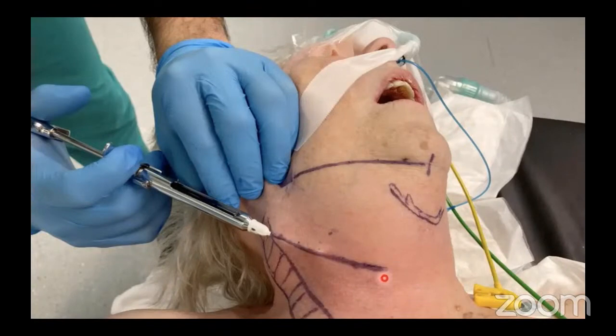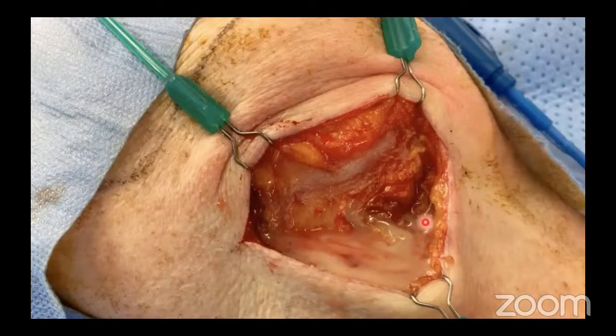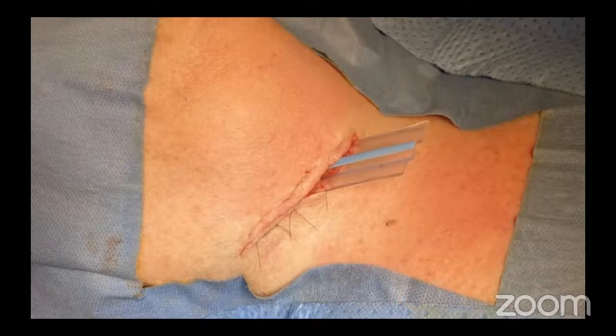The approach is an external transcervical approach, going below the angle of the mandible within a convenient skin crease. We've marked some marks here, the hyoid bone, and this is the anterior border of the SCM. The subplatysmal plane is elevated. You can see the facial vein here being pushed laterally, and the minute we incised the platysma, we had a lot of pus out. The facial vein was ligated and retracted caudally. A blunt dissection was made towards the direction of the submandibular gland, and a finger dissection released more pus. She did very well and had a corrugated drain that was removed a few days later.